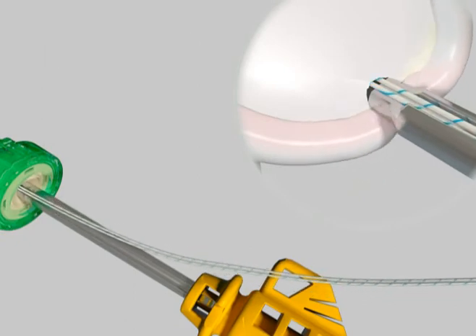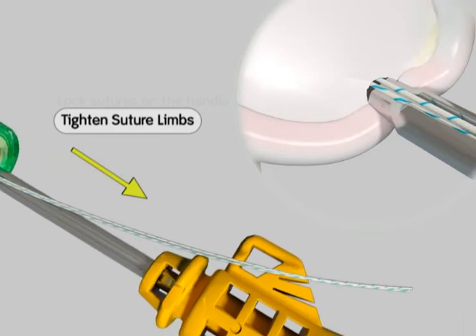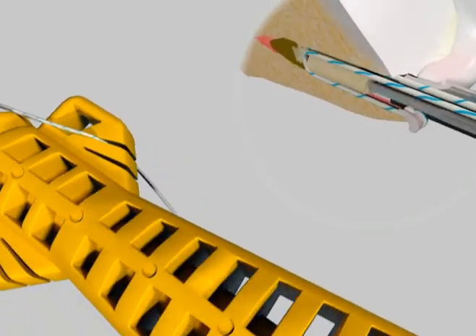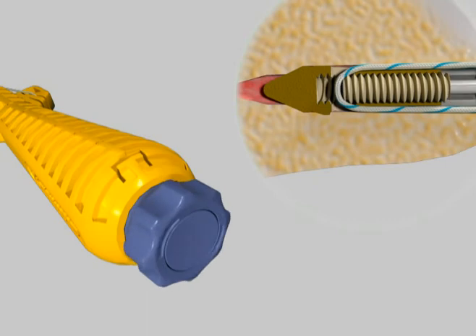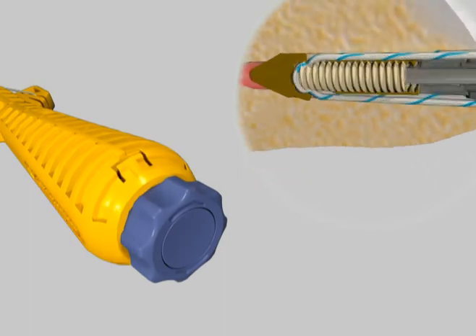With slight downward pressure on the inserter handle, manually pull the suture limbs, either individually or together, to tighten the suture across the labrum and lock them on the handle. Once tight, rotate the torque limiter on the end of the handle clockwise about 8 turns until several clicks are heard to lock the sutures into place.